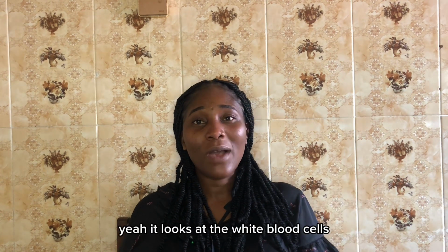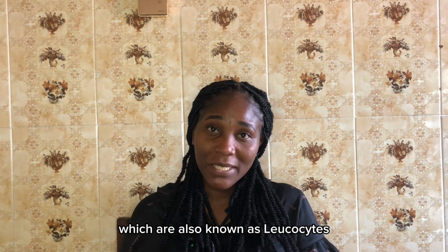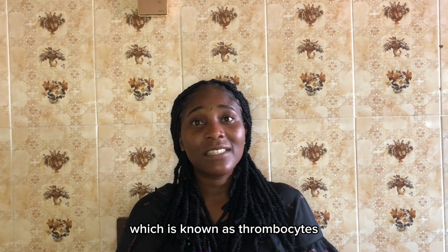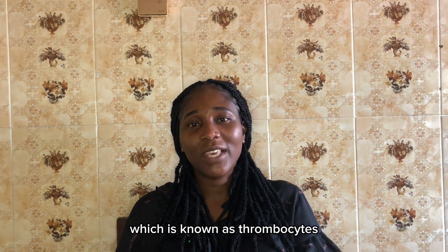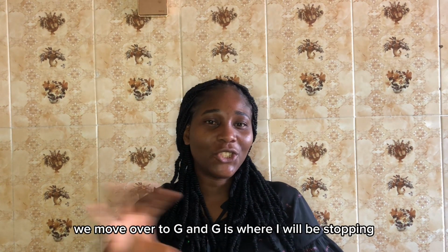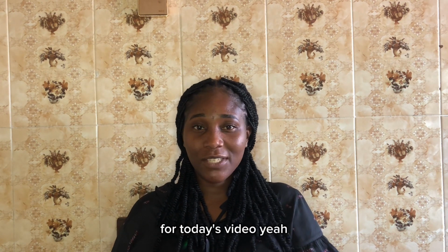It looks at the white blood cells, which are also known as leukocytes or WBC. It also looks at your platelets, which are known as thrombocytes. Okay, so that's for the F. We move over to G, and G is where I'll be stopping for today's video.